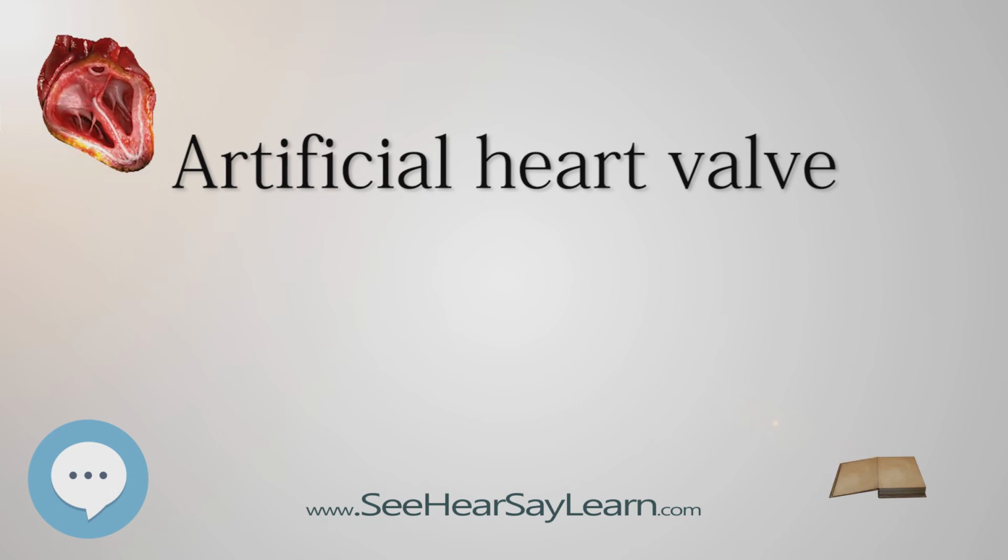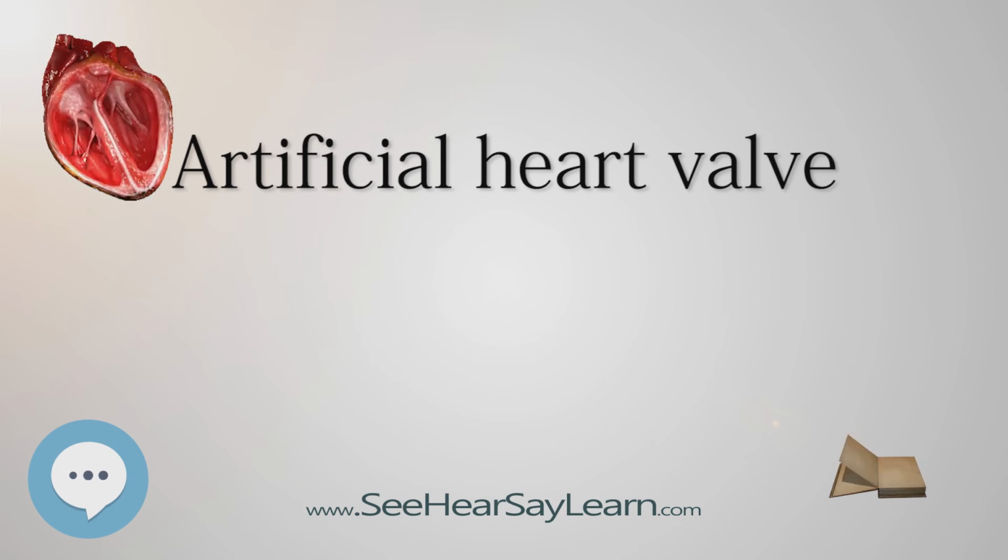Clinically, cavitation is of primary concern in the mitral position. This position is especially harsh due to the sudden ventricular pressure rise, which drives the valve closure against a low left atrial pressure, which is said to be the worst case condition for cavitation to occur. Cavitation is also suspected as a contributing factor in blood cell damage and increased risk of thromboembolic complications.